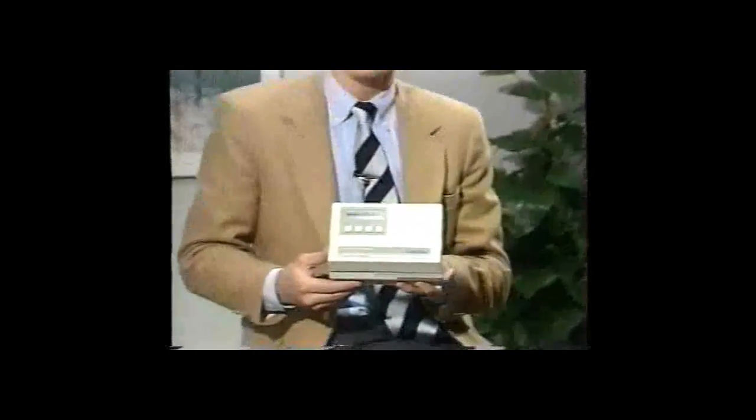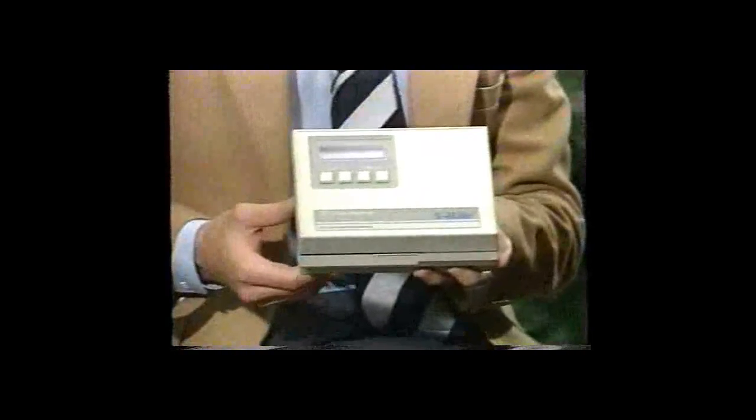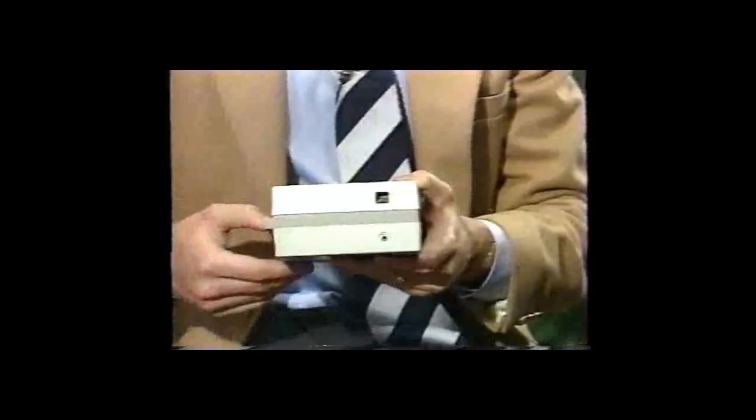Once the film is processed, move to the Model 381 densitometer to analyze the step wedge. The 381 is a portable, stand-alone device designed to scan a 21-step wedge and calculate your control parameters. It is operated by a four-function keypad and powered by six rechargeable NICAD batteries. The unit warns you when batteries are low, and is also equipped with an electrical outlet so you can plug it in to operate the system and recharge the batteries simultaneously.